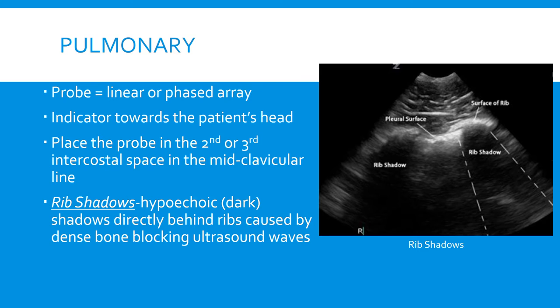The first thing I want to talk about is rib shadows. Rib shadows are hypoechoic or dark shadows that are directly behind the ribs. The reason you see these shadows is that the ribs are so dense that the ultrasound waves can't penetrate them, so all you see is a dark shadow behind the ribs.